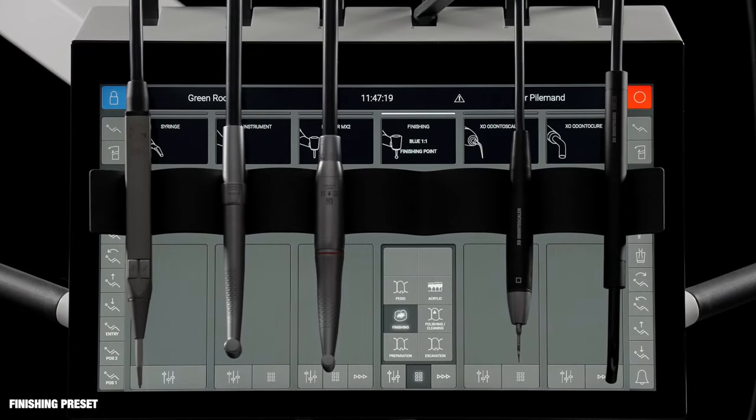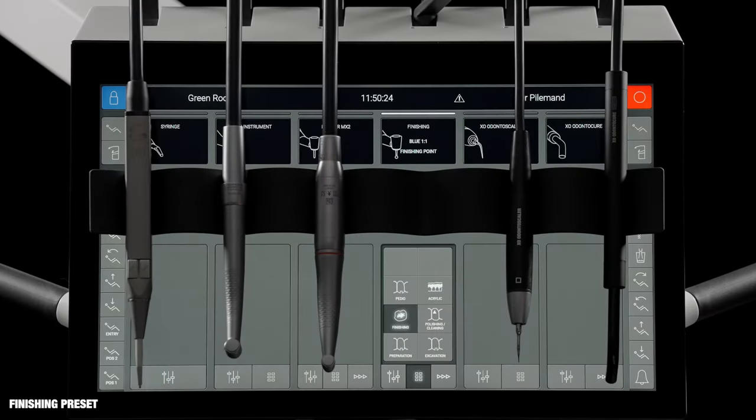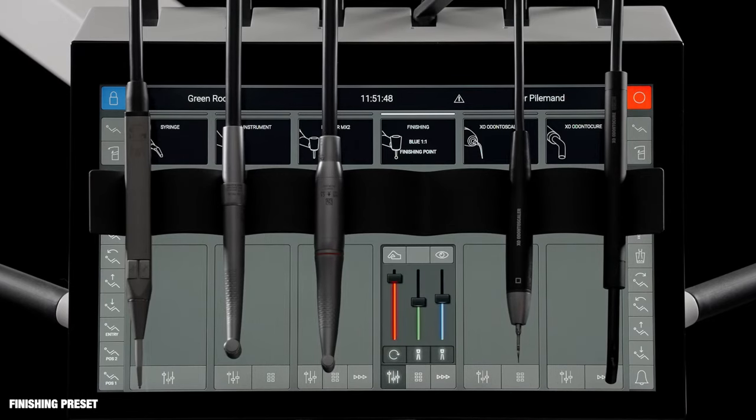Activate another preset with just one click. The finishing preset provides optimal instrument settings for finishing a composite restoration. The operators are instructed to fit a blue contra-angle and a finishing point. The speed of the point may be regulated up to 25,000 RPM using the foot control. In the finishing preset, the amount of spray is moderate, and the tactile function and automatic chip blow are disabled.